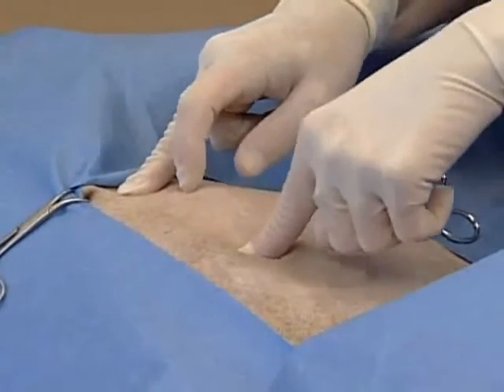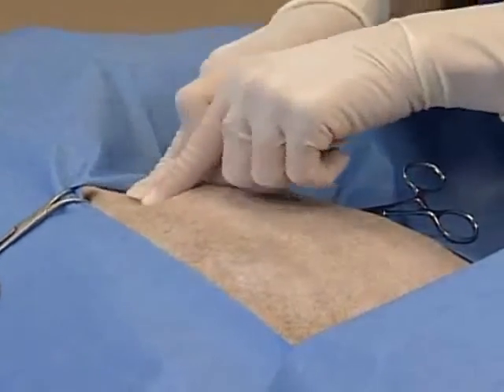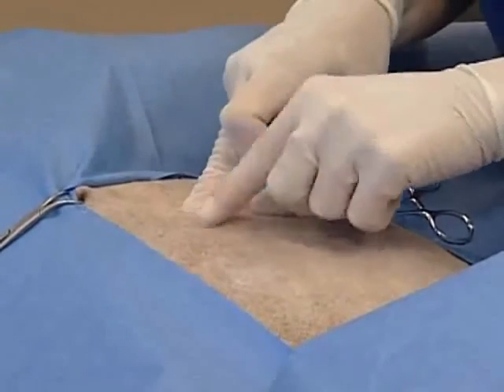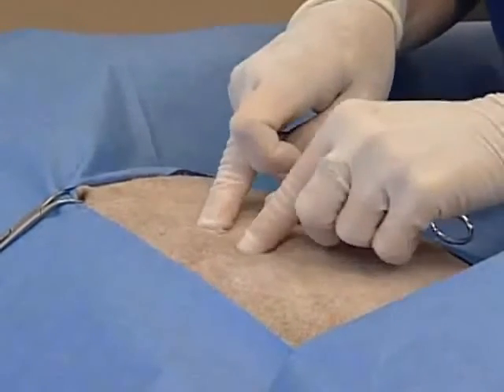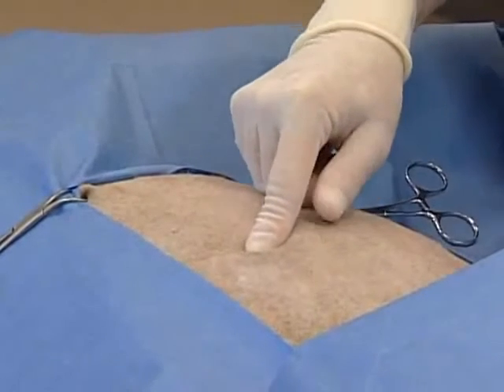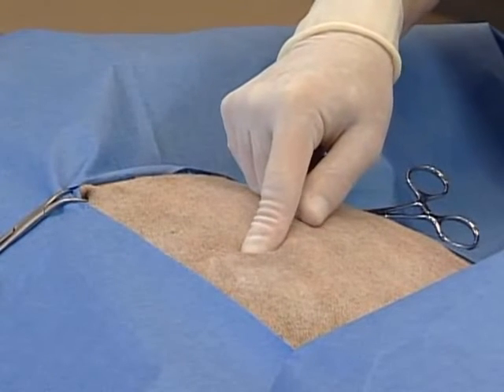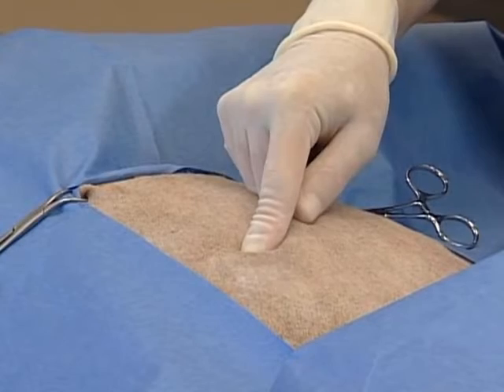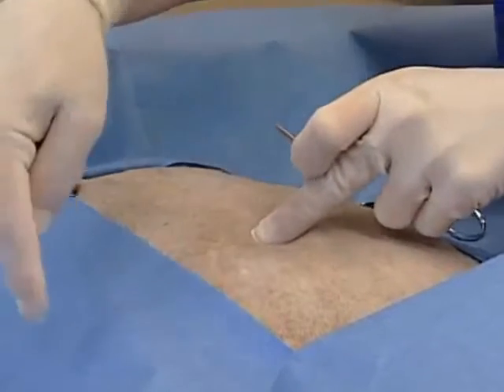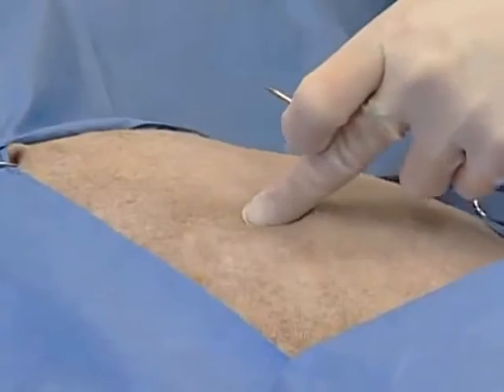Once you've identified the space, take a scalpel blade and make a full skin-thickness incision midway between the dorsal midline and the ventral midline.